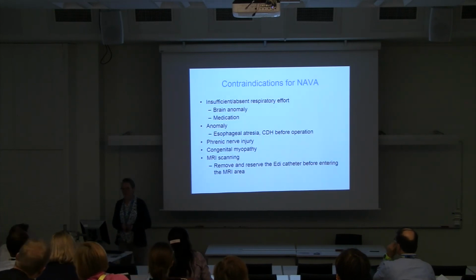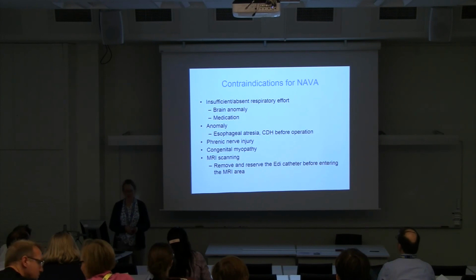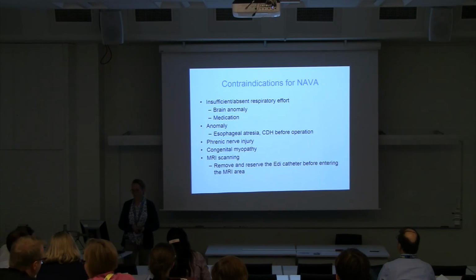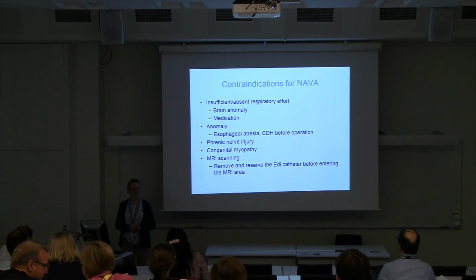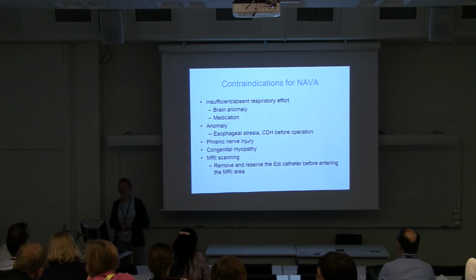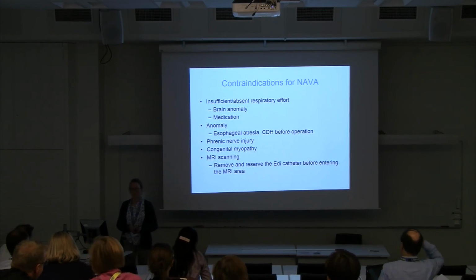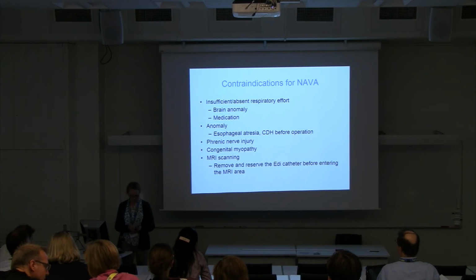There are some contraindications. If the baby doesn't have sufficient respiratory effort, like brain anomaly or medication, in esophageal atresia or congenital diaphragmatic hernia, you cannot insert the catheter before the operation. Also phrenic nerve injury or congenital myopathy, and before MRI scanning, we need to remove the EDI catheter.